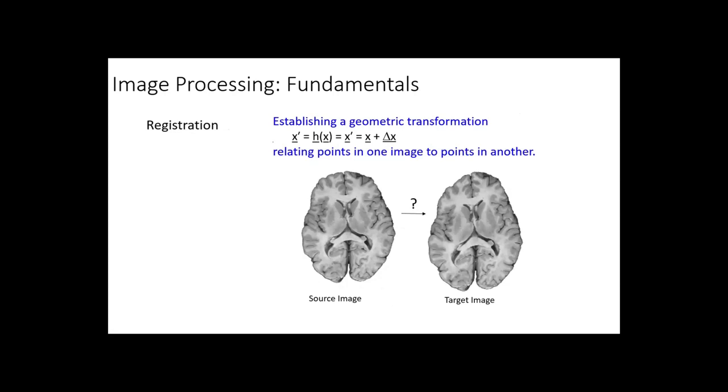Right. And the last part I want to talk about, this is not last, this is second last, is image registration. What image registration does is, this is what we call the source image, another is the target image, right? So they look different. We want to find their spatial correspondence, like for this one, we want to find the correspondence right here.